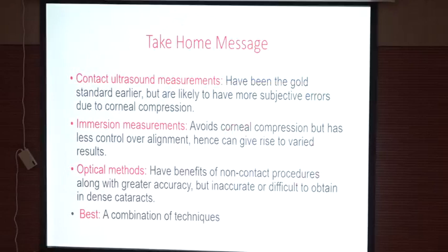So the take-home message would be: contact ultrasound measurements have been the gold standard, but can have subjective errors due to corneal compression. Immersion measurements avoid corneal compression but have less control over alignment, so they can give varied results. The optical methods have the benefits of non-contact procedures along with greater accuracy, but sometimes in dense cataracts they can give us false readings or are not possible. So overall, a combination of techniques can be used.